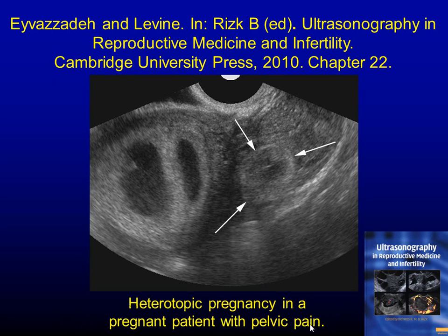The patient, we scan her, and this is her uterus, so she has twins inside the uterus, and you look at the fallopian tube, she has an ectopic pregnancy. So this is a heterotopic pregnancy. Heterotopic means what? Means combined intrauterine and extrauterine. Under normal circumstances, the odds of that is 1 in 30,000. With IVF, the odds are 1%. So it moves from 1 in 30,000.